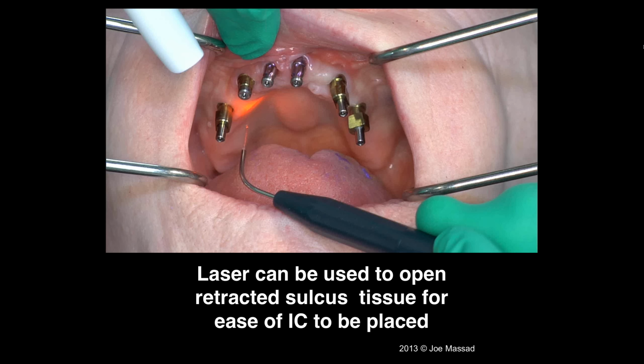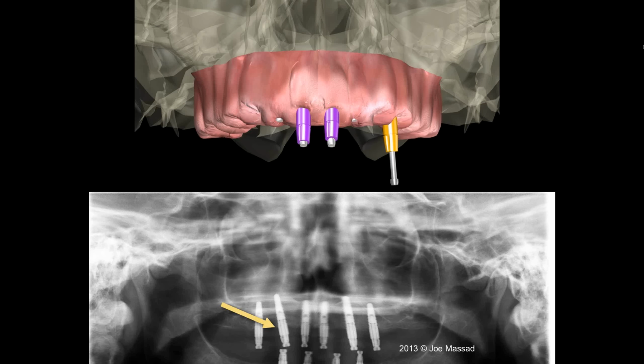Another tip on making sure that you seat it correctly is that we don't push the locking screw all the way in. We need to get the bilobe, trilobe, quad lobe hex. We've got to be able to engage that tactilely before we engage the locking screw, because if the locking screw is all the way pushed up, many times we will not be in that locking position, and you can tighten it, but there'll be a space. And then of course we do a radiographic review of all this.